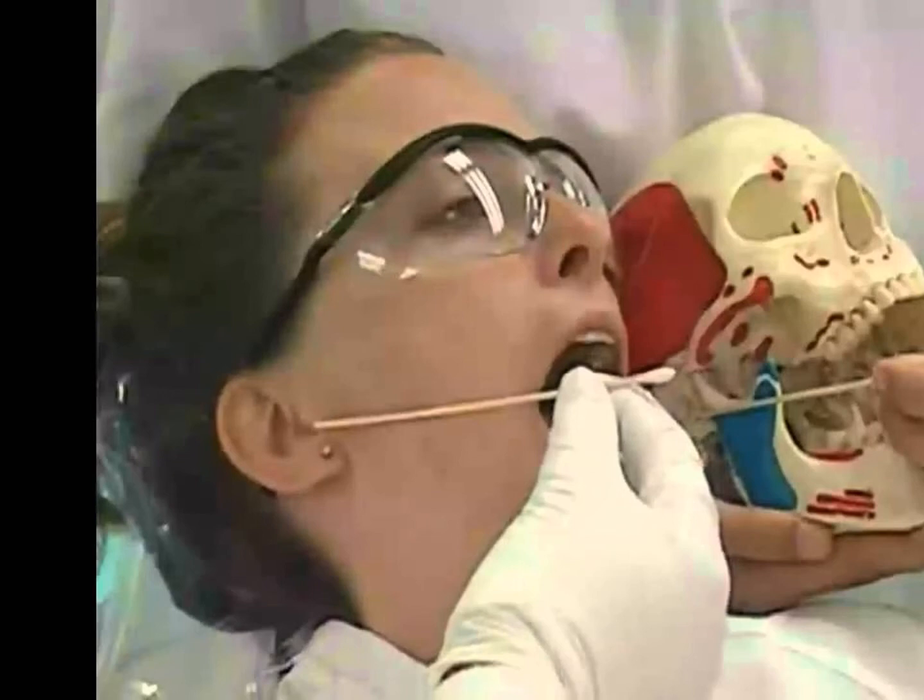This shows you what you can line up with. You can line up with the corner of the mouth on the commissure and all the way straight across to the tragus of the ear. And if you make an imaginary line between those, that's the direction that it's actually going. You feel like when you're in the mouth that it's going completely up, but it's going up and back, and that's where it's going to be contacting the condyle.